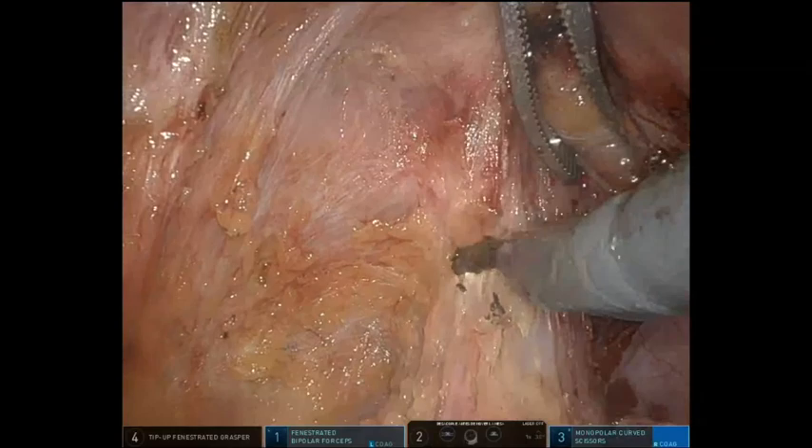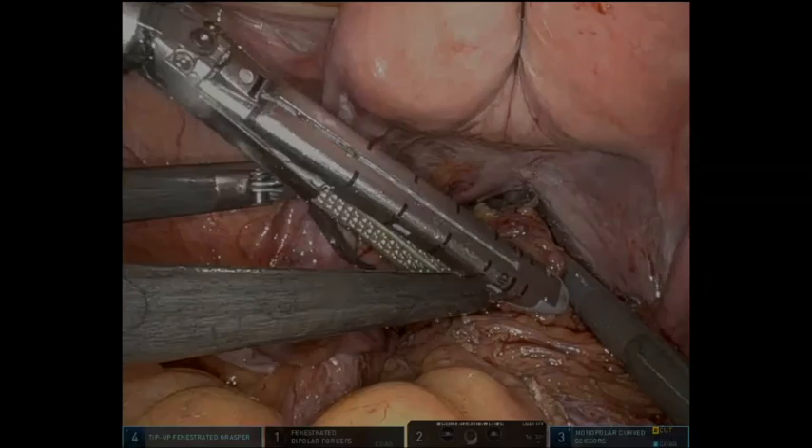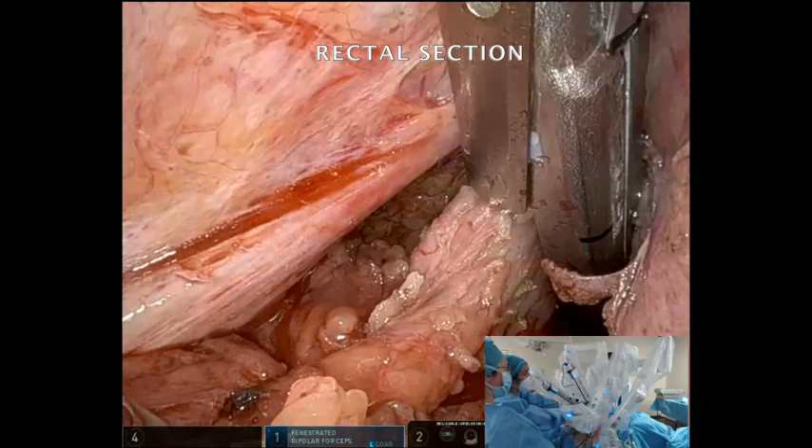Rectal transection is completed. Two loads of 45mm medium-thick endo GIA are used in this case. The specimen is extracted through a Pfannenstiel incision, which will also be used to perform the ileal pouch. The terminal ileum is transected with a 60mm medium vascular endo GIA.